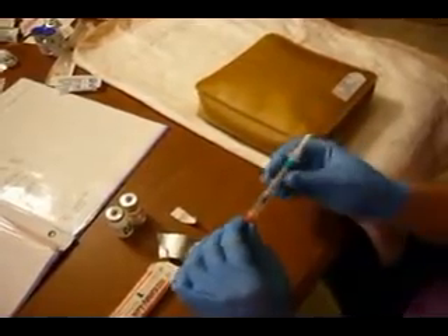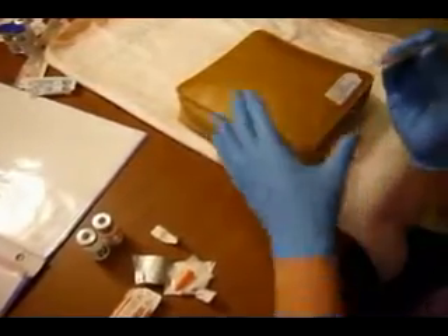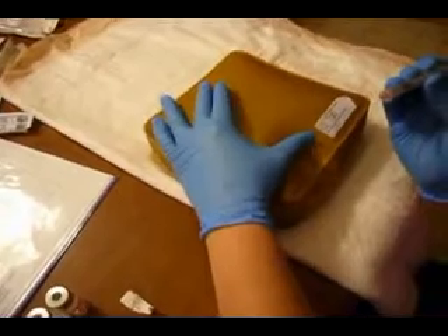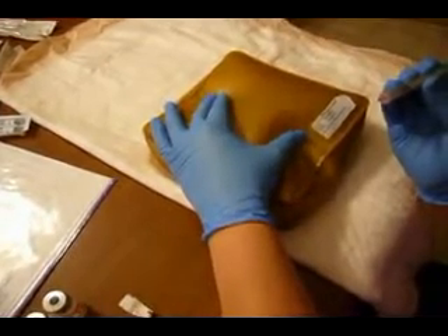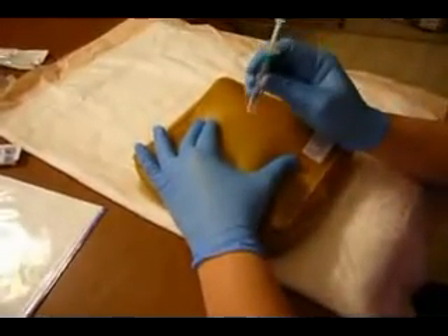Once this is dry, you're going to take the needle cover off. You're going to hold the syringe like a dart. You're going to come and gently tent the skin up because you want to bring the subcutaneous tissue up off the muscle layer underneath. You're going to gently tent it up and stabilize your hand right here.